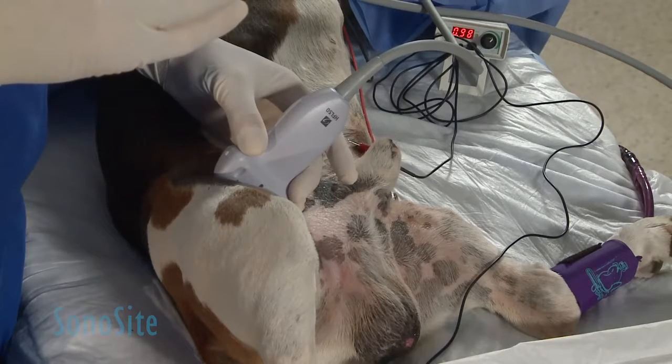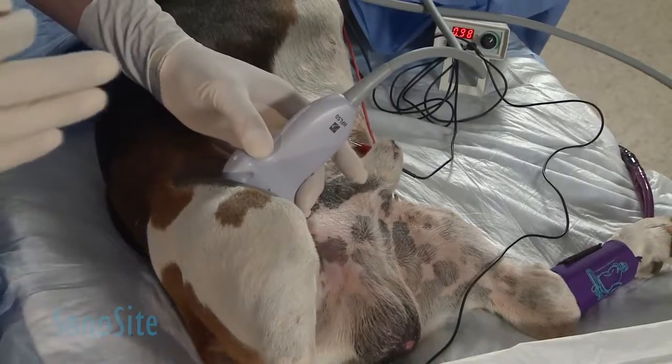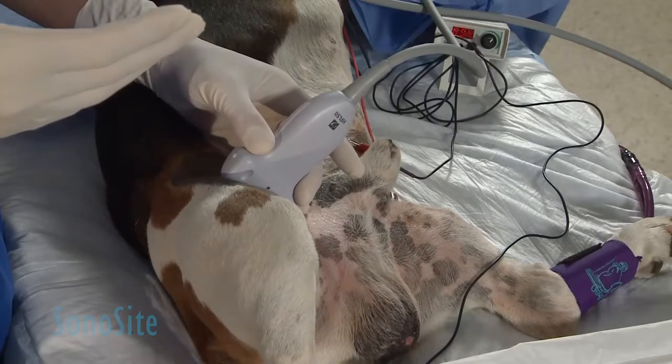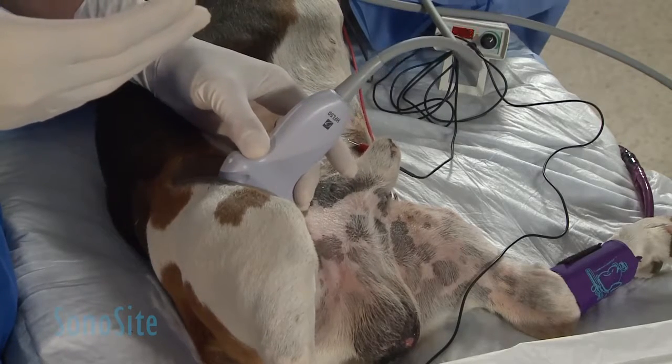Once I identify this image, I need to be careful to make sure I'm not injecting my local anesthetic into the vasculature. So I need to move it a little bit out of the plane of that vasculature once I identify my femoral nerve.